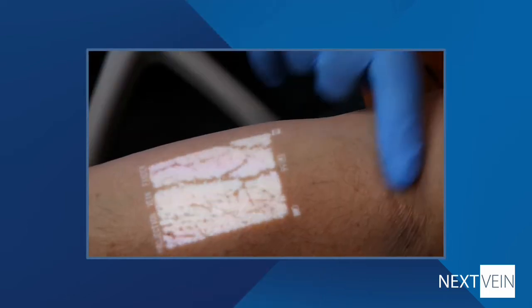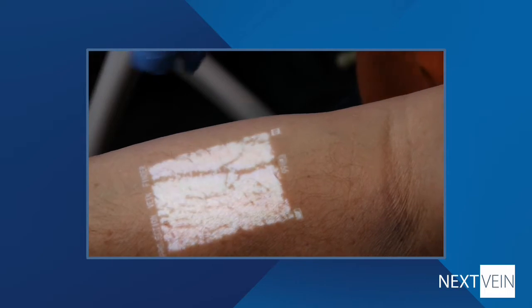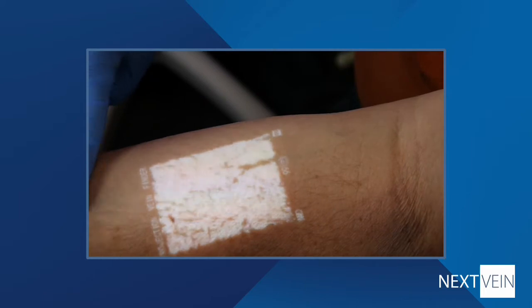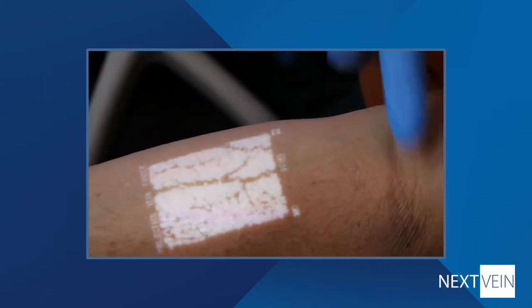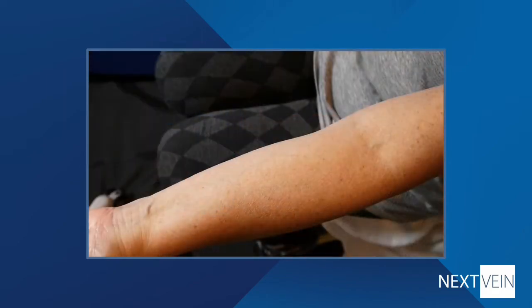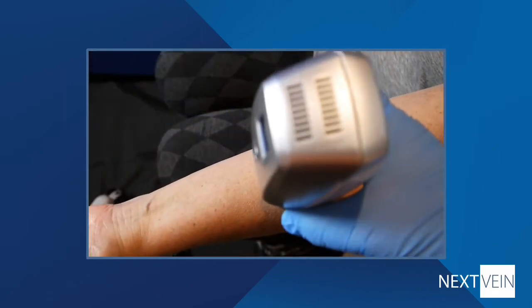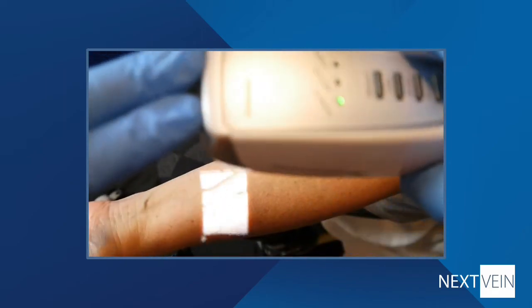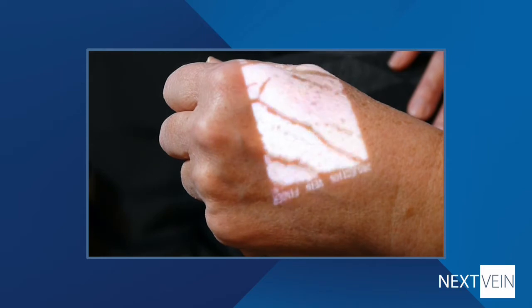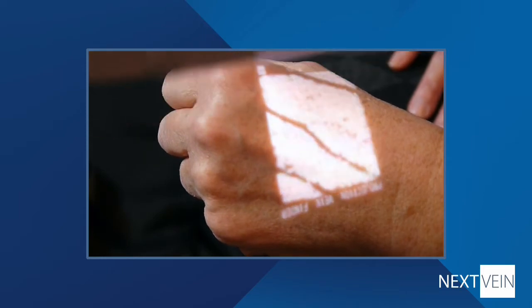To use the device, simply hold it over the patient's skin at a distance of 8 inches, plus or minus 1 inch. This extended working range makes it easy to properly position the device. An easy way to estimate the distance is to remember the device is 9 inches long. You'll know you're at the right distance if the words 'projection vein finder' are in focus.